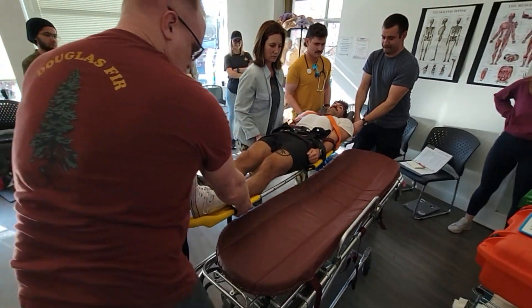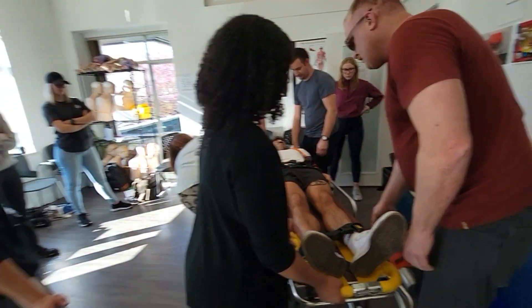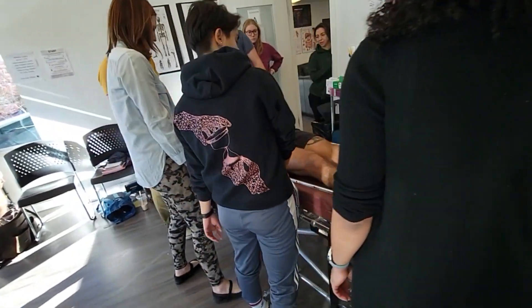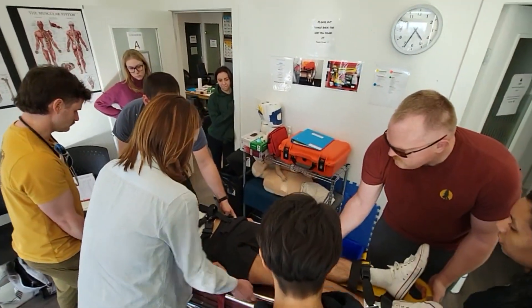Okay, nice. And then the next thing we're going to do — let's shuffle him down a touch. Okay, so three, two, one — yep.